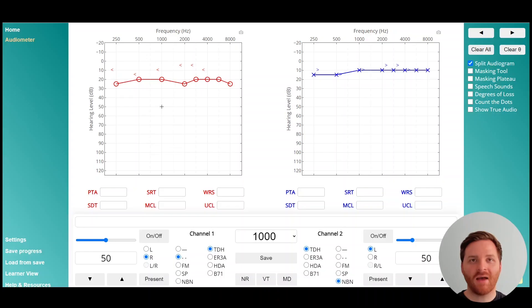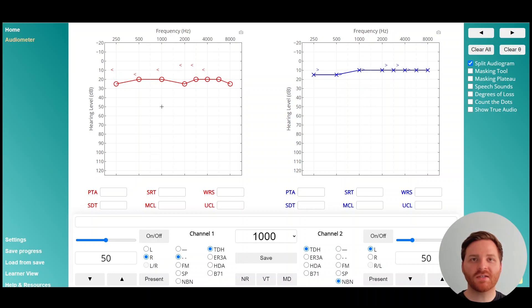Hey again. We've got another video here demonstrating bone conduction masking. I've designed this audiogram here that just has slightly worse hearing in the right ear compared to the left ear. We're going to use this as our example for bone conduction masking.